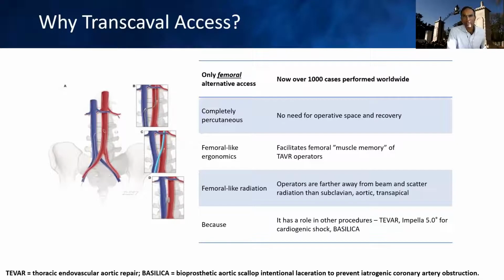In terms of radiation exposure, some of the scatter radiation may be less, given that the operators are in their normal positions, as you would be for a routine transfemoral case. And learning this technique affords some parallel work for other types of procedures, such as placement of left ventricular support devices and other large bore devices. The technique, although it may seem intimidating at first, is typically reproducible and similar from case to case.